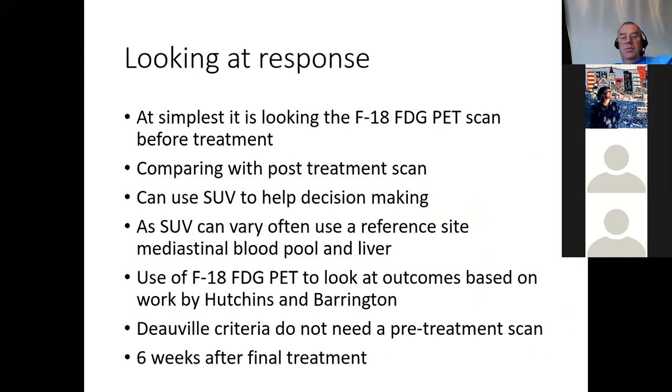Looking at response has become another really interesting area with lymphoma. I'm going to do this in a lot more detail in next year's more advanced course, but we're just going to give you some ideas of what we've been doing. The easiest way is to compare the pre and post therapy scan and use the SUV to help with decision making. How does that change? But the problem is SUV can change for various reasons, including uptake in other organs, such as in the bone marrow with anemia.